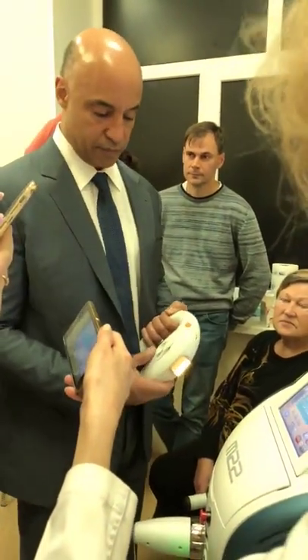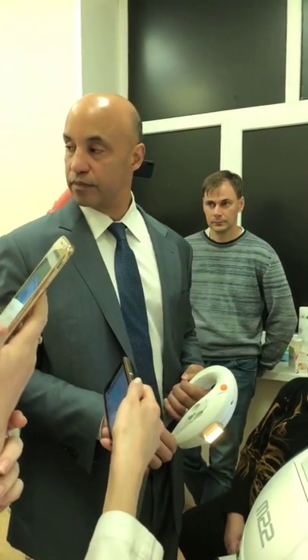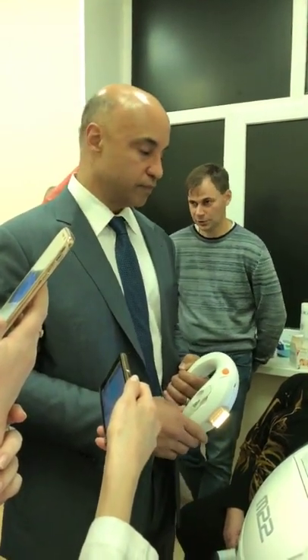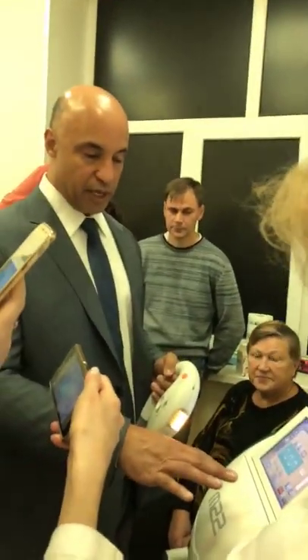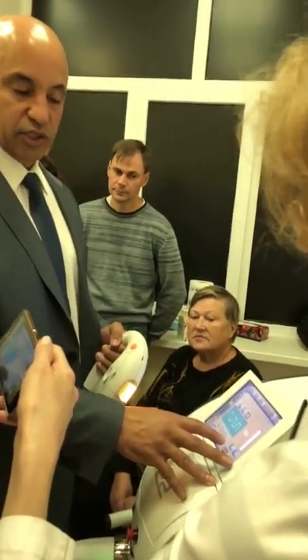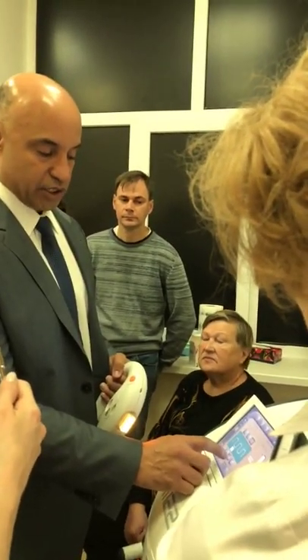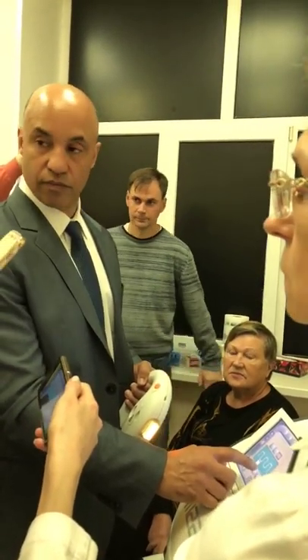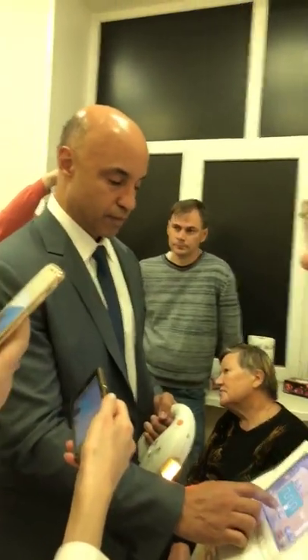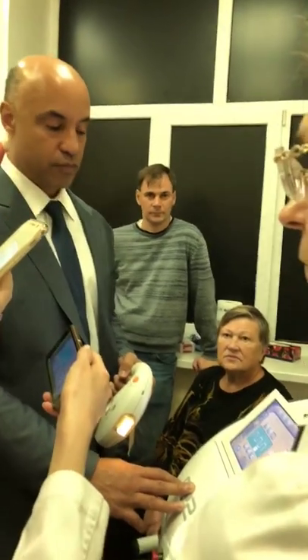So, go ahead. У нас получается, что время стандартное, что вот этот тройной импульс мы ставим всегда, время одного импульса 6 миллисекунд, мы как тоже всегда ставим. И что мы можем регулировать, только время между импульсами, потому что когда темная кожа, то да, больше мы делаем время паузы. So say for example, somebody comes in even darker than me, you tried 10 joules of energy and they're still saying it's painful, then the one thing that you can do is you can actually increase the thermal relaxation time. Если происходит темный, скажем, темнее, чем у него кожа, то мы начинаем 10 джоулей, у нас стало 50, а он чувствует, что больно, да, пациент, и мы прибавляем это время, скажем, 100 получается, время между импульсами.